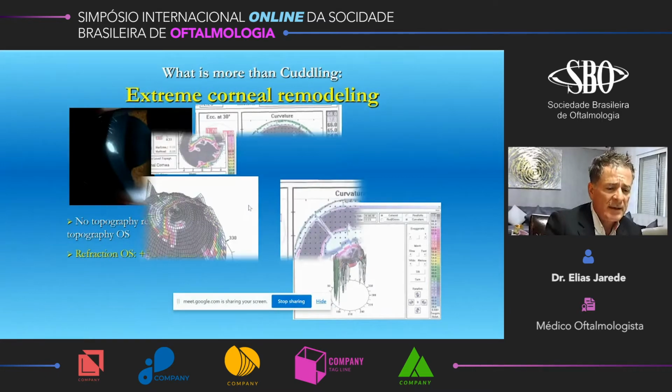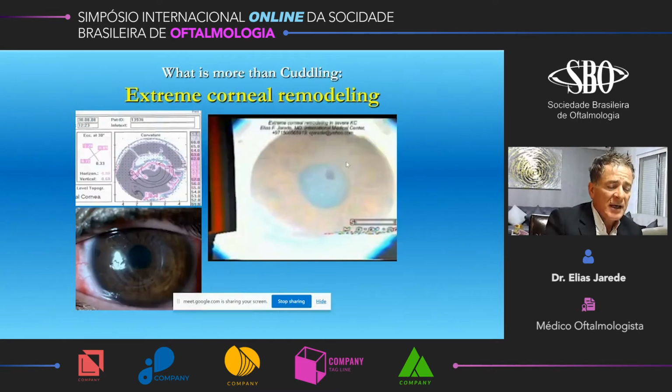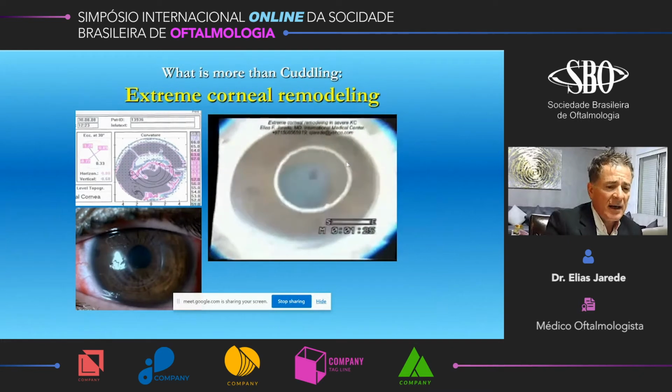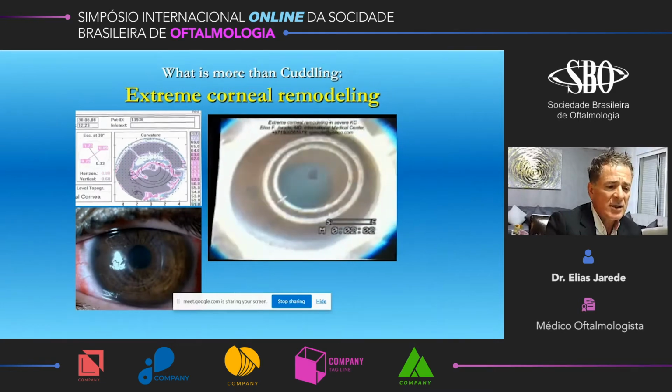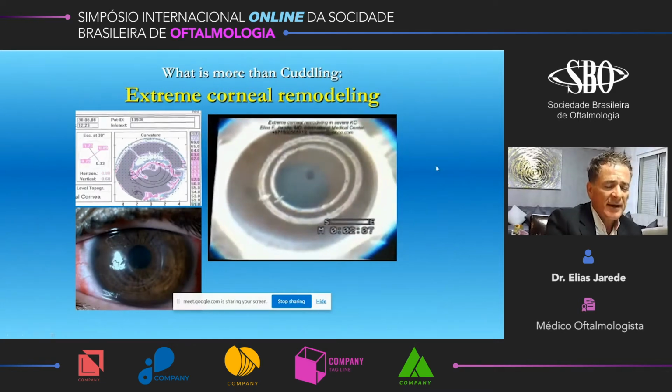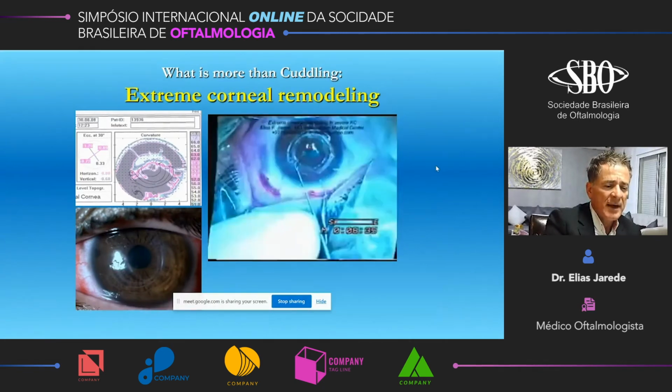We made a plan to do one 210 Keraring SI5 internally and one Intacs superiorly. We call this the Wonder Bra technique. We're using the same Intralase with the same applanation, one internal tunnel and one external tunnel at two different depths, not too far from each other, with some spare interval.